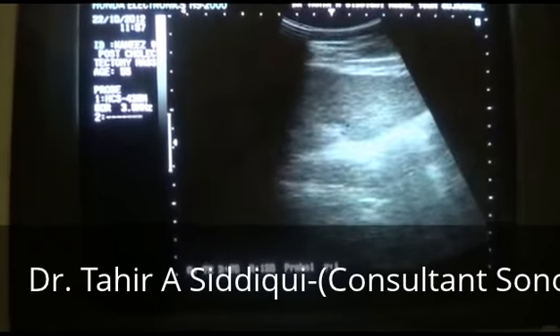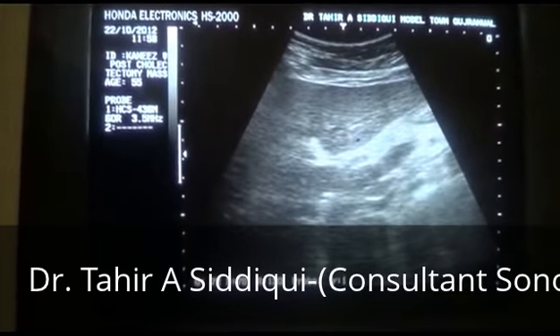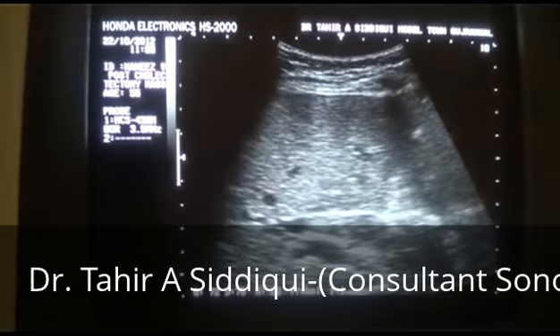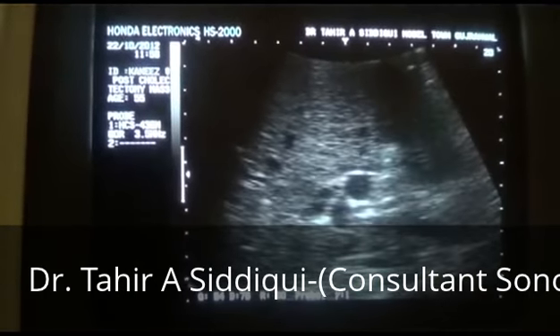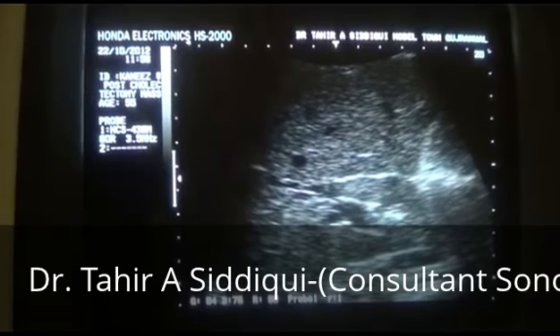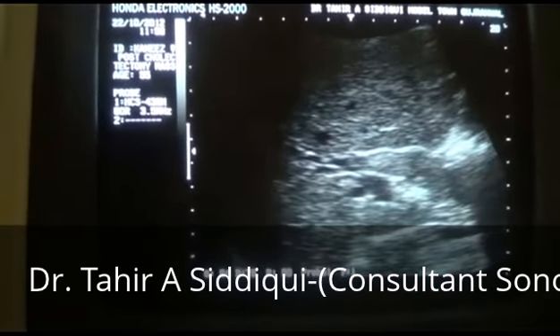And this finding, keeping in view the history of the patient having fever with rigors, with the common bile duct filled with sludge, is consistent with cholangitis. However, the possibility of a tumor sludge cannot be ruled out by ultrasound.